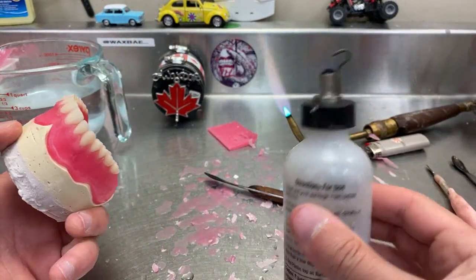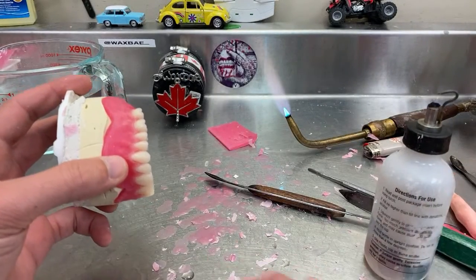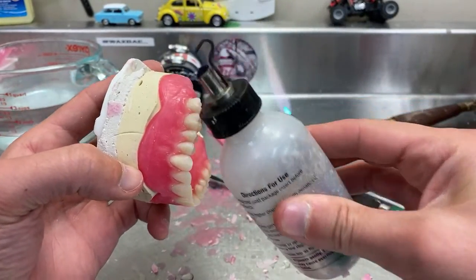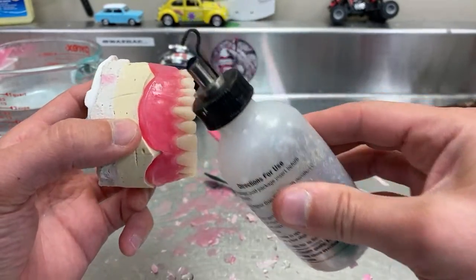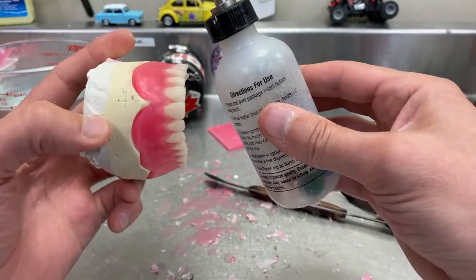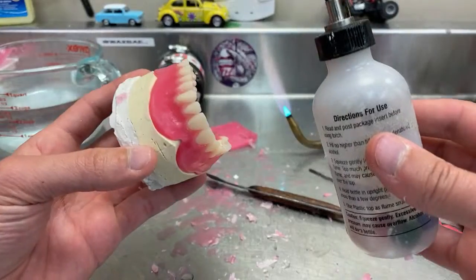I don't know if you've seen my video of how I do this. Kind of like in a curved motion, and one hit or a couple maximum. But I like to go all over the place. So I'm working now on the top. I'm not going on the teeth yet, just kind of warming everything up before I jump into it.